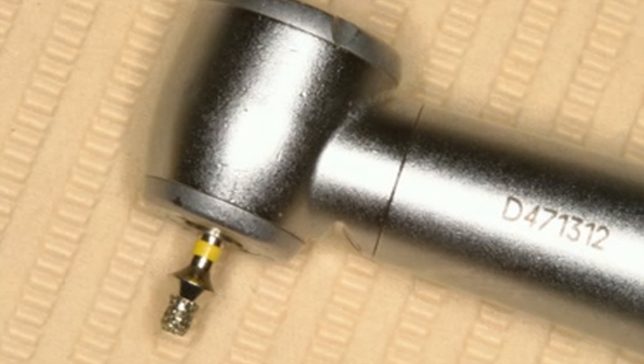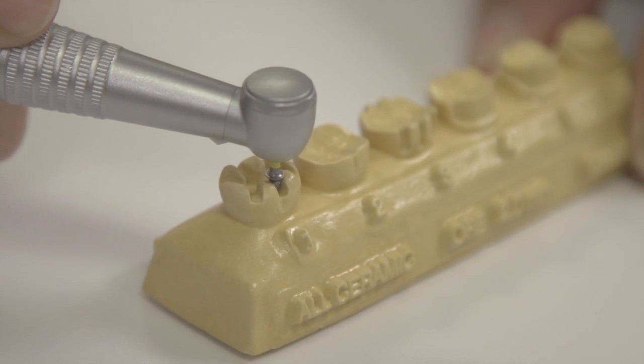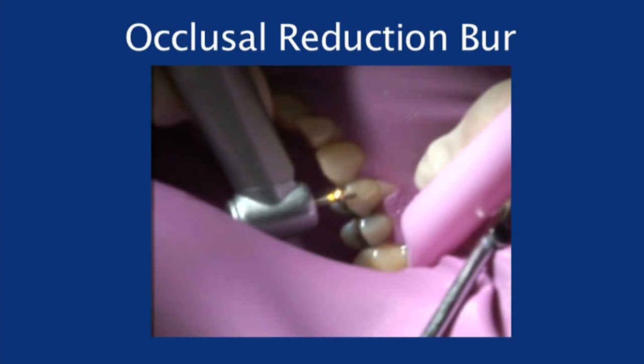As you'll see, there's a diamond-cutting surface with non-cutting bevels. This allows the doctor to be able to get inside the occlusal surface and go up the walls to get the proper depth.